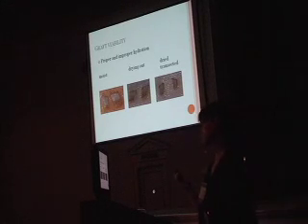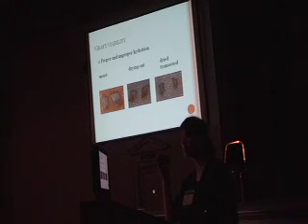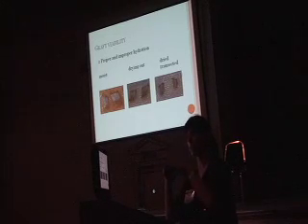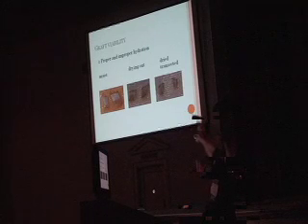Interestingly enough, I find that if they are not hydrating grafts often enough, they just lose that little shininess, and that is what you have to monitor. So once in a while you can walk through the room and look at whether their grafts on the hand are still shiny. You don't have to be there all the time, but you have to be aware of what to look for. You will rarely see a graft like the one on the far right, totally dried out. You will see something that is just slightly losing the shininess.